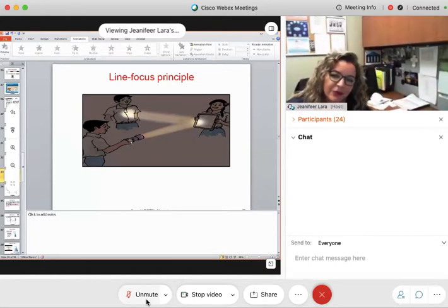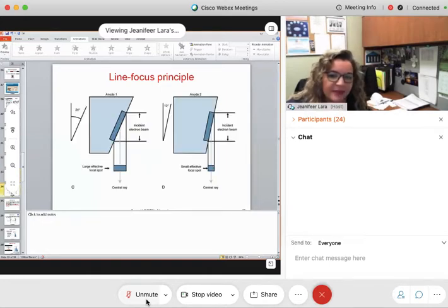So as this person redirected the light to this person by angling this mirror, the concept is the same. We are going to take the electrons that bombard at the actual focal spot, and create an effective focal spot to guide our X-rays out of the X-ray tube towards our patient.